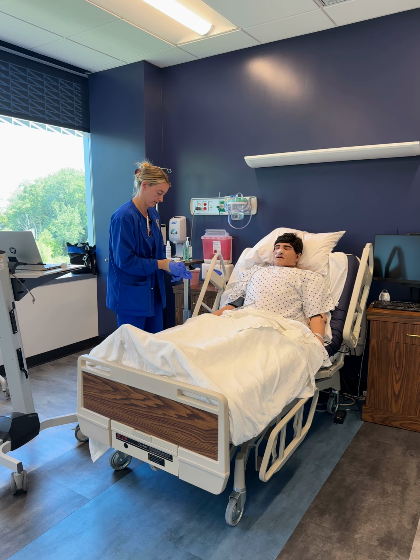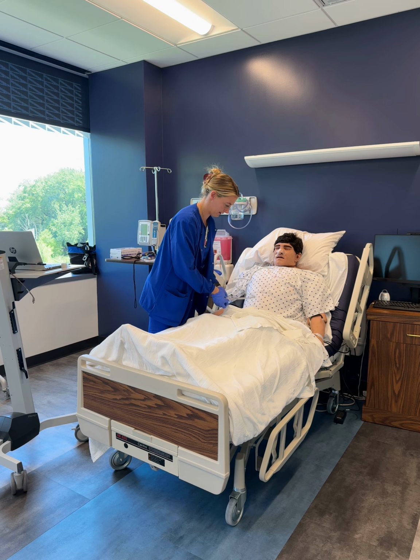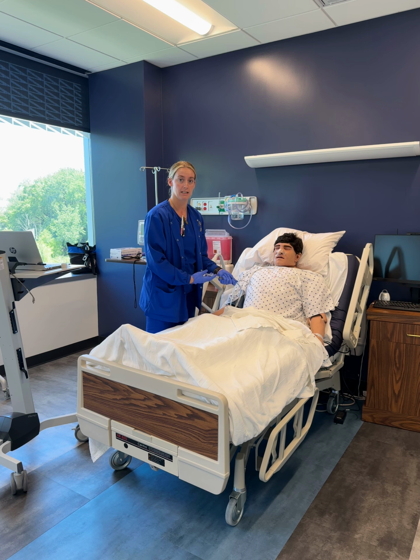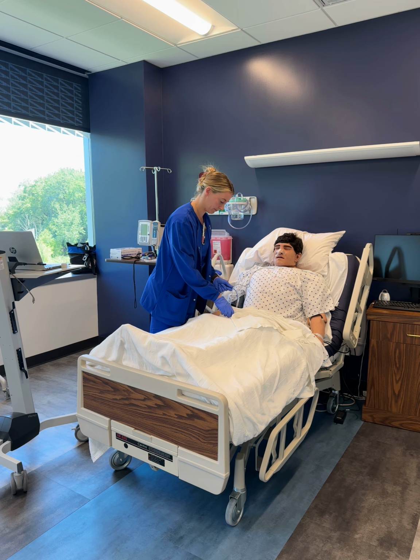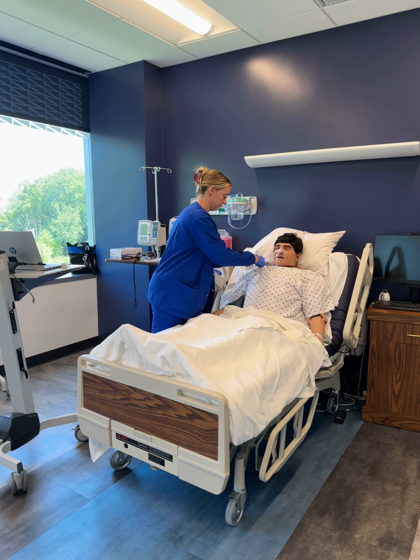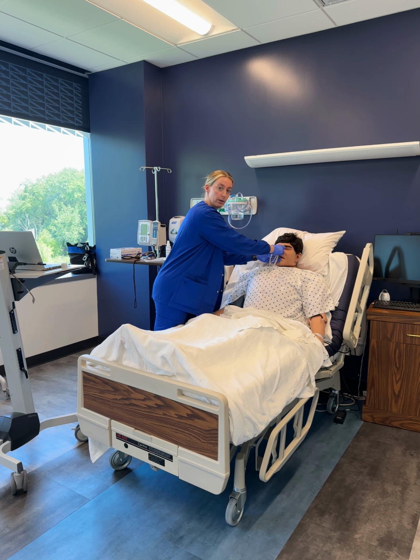We're going to insert 20 of air into the NG tube. This was connected. I'm going to remove the tape from the gown and the tape from the nose, not pulling out the tube just yet. Telling the patient to hold their breath when I'm pulling it out.